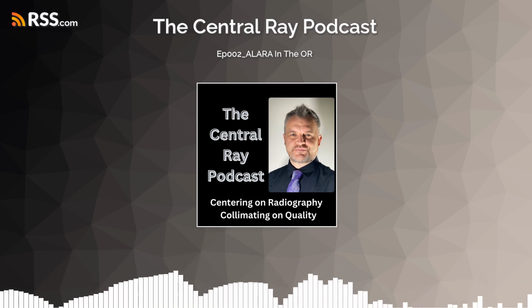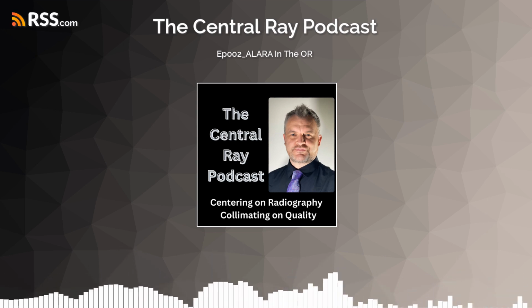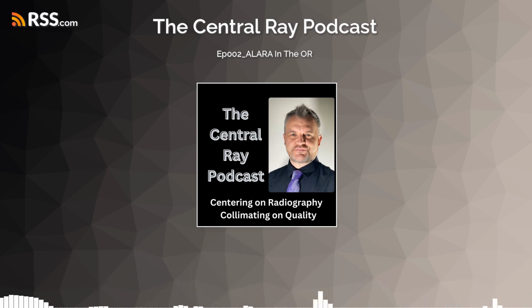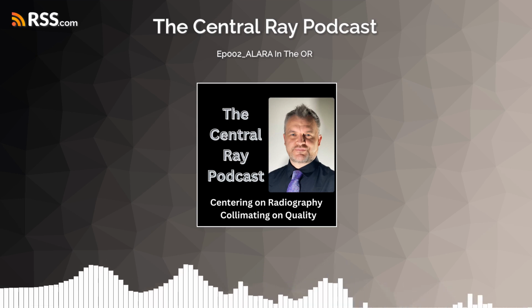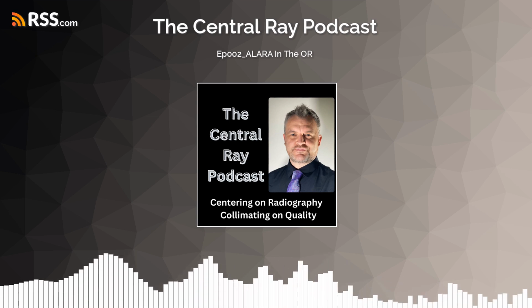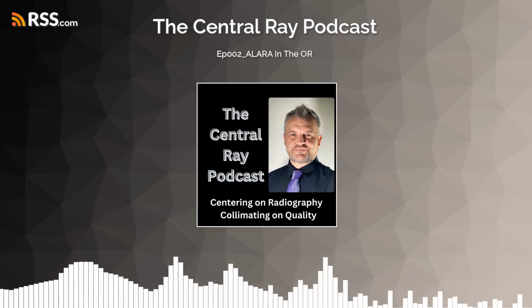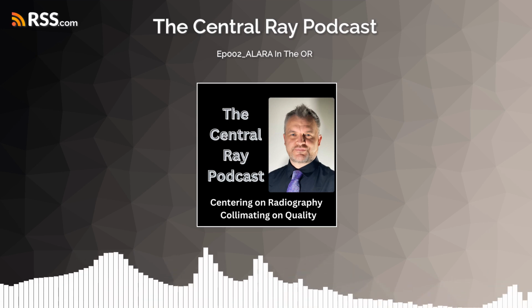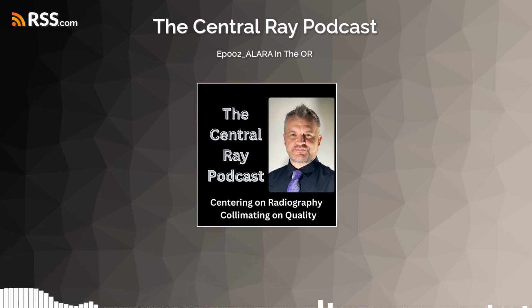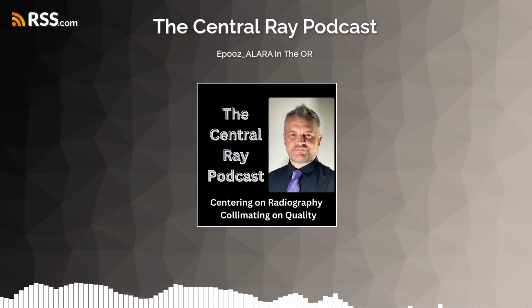Today I want to talk about ALARA in the OR, and how our perception of ALARA as coming from radiology is not really the way we probably want to think about ALARA in the OR. Obviously, within radiology, when we consider ALARA, we are looking at maximizing our SID for the study. In terms of image quality, we are also looking to minimize that OID, so getting the part of interest as close to the receptor as possible.